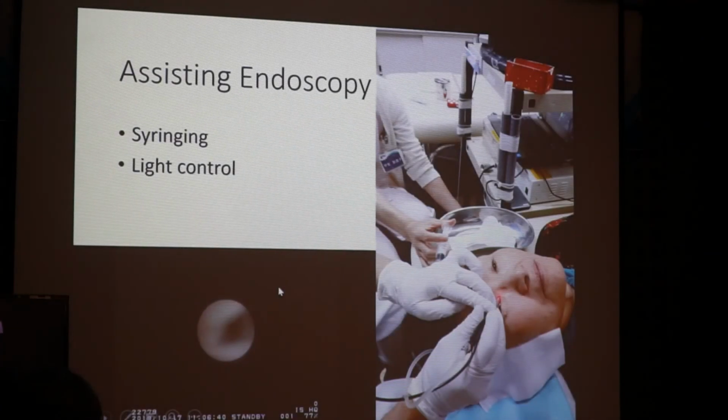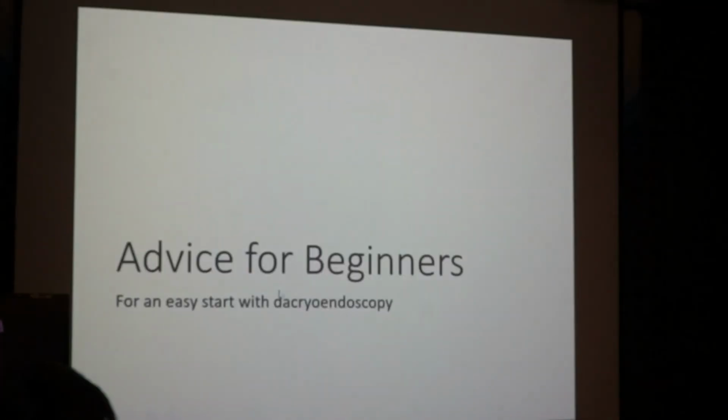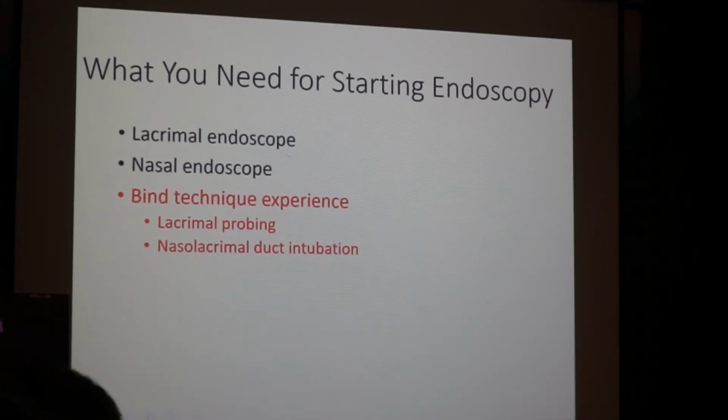So the next part is not so important. The final section is important. Advice for beginners. So what do you need for starting endoscopy? Of course, a lacrimal endoscope and nasal endoscopy are required.